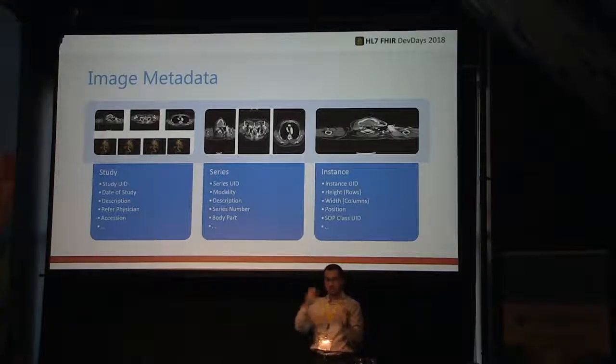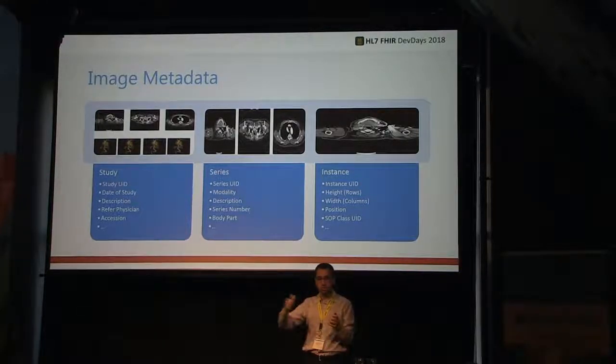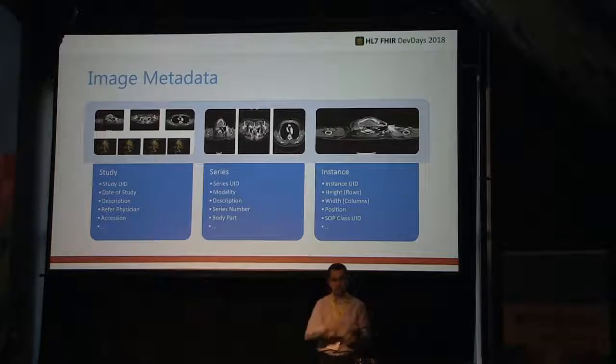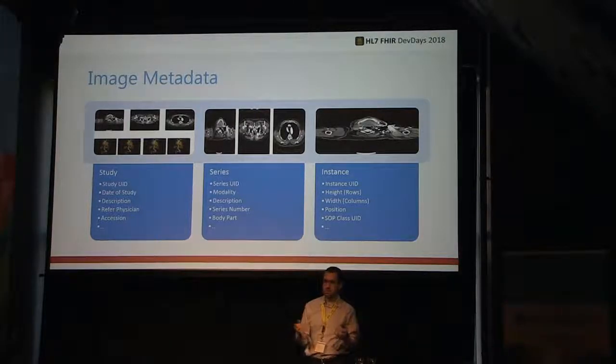At each level, there is metadata stored in DICOM to go along with this. And again, this is one of the reasons why you have DICOM versus just, say, stored as a JPEG file, because it always keeps the metadata. Well, someone says, hey, but my JPEG keeps metadata. It has the latitude and longitude of where I took it. That is correct, but this is a whole different level of metadata that DICOM is built to store, much more.